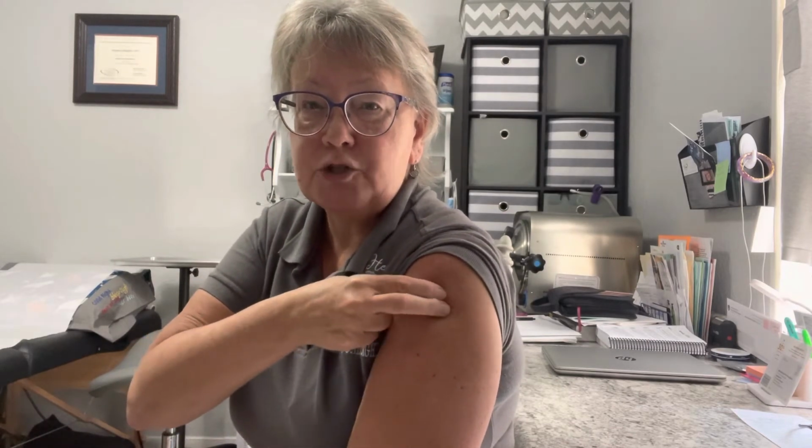But if you do have a family member who's willing to provide you with the injection, they can use your shoulder. So to find the right place in this muscle, it's not down here like you see on TV shows. You want to get up here and find the shoulder bone and put your fingers, 2 fingers. Some people say 3, and that's okay. That's only about a half inch difference. But you want the medicine going in the biggest part of the muscle, which is right here. And so we find the bone, we put 2 or 3 fingers, and then the medicine goes right here.